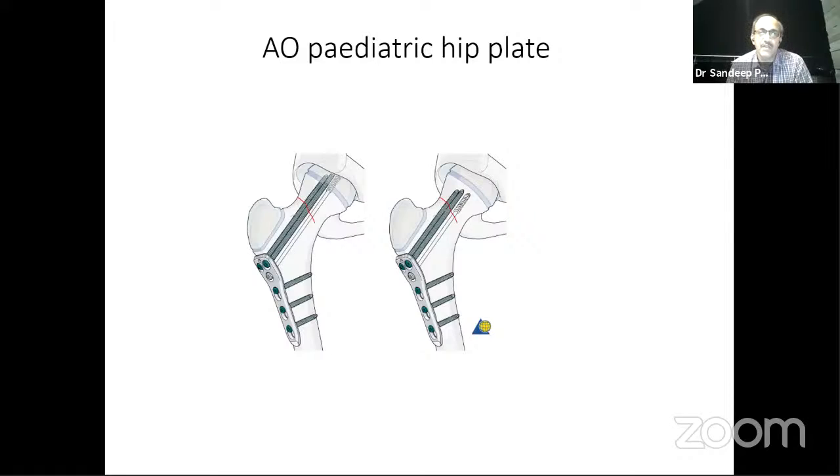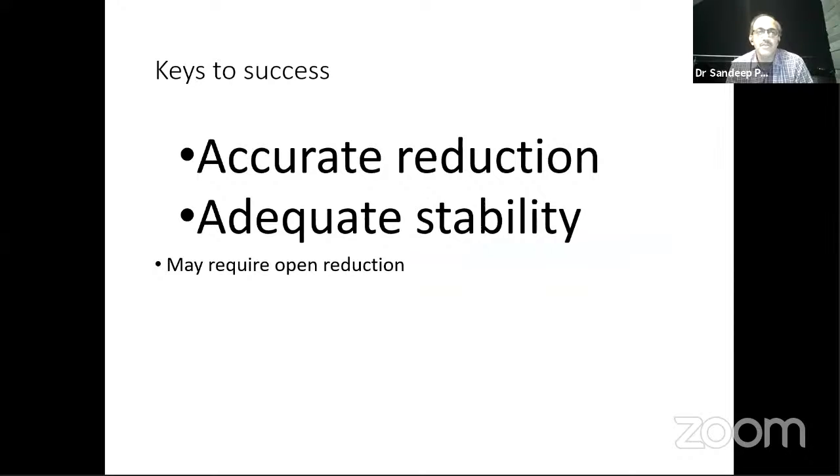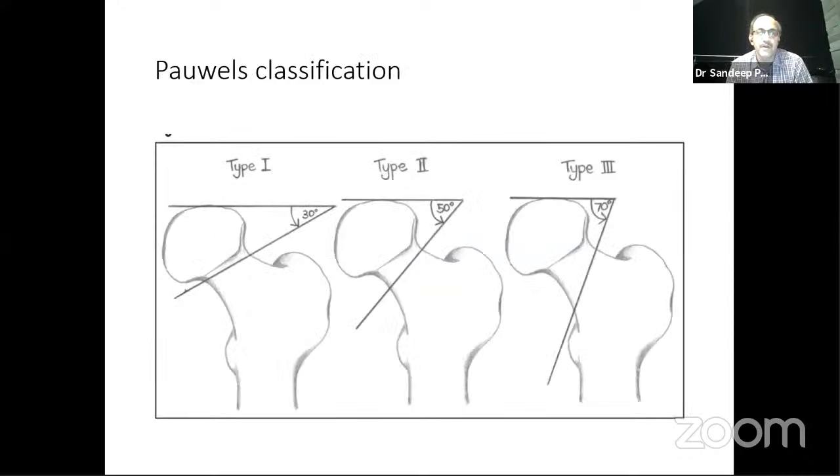Of course, now we have the AO pediatric hip plate for those who can afford. Again, affordability, because this plate costs about 35 to 40,000 rupees. So the keys to success are an accurate reduction and adequate stability, which may require open reduction.